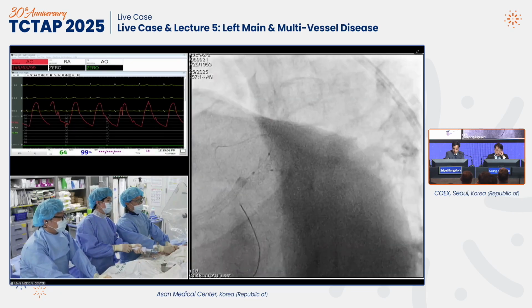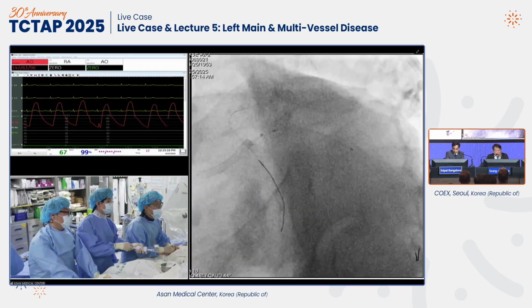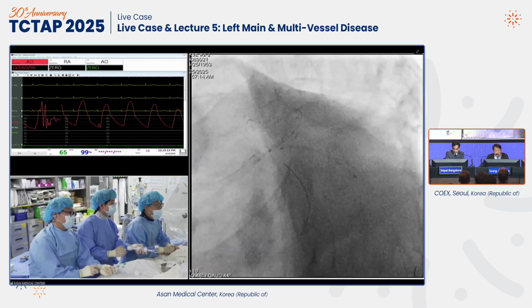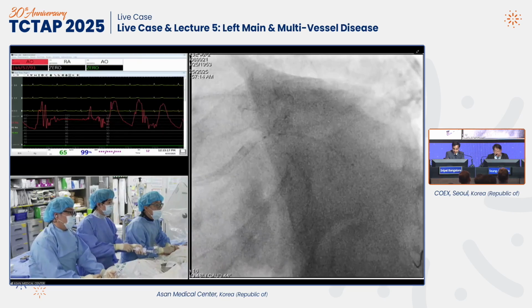Any comment at this moment? It's not yet. Okay, pull down. Test. Okay, great. Mini crush. Okay. Pull in. Okay, test.